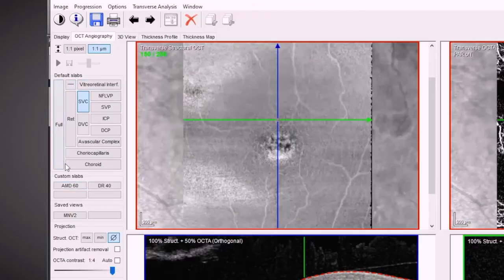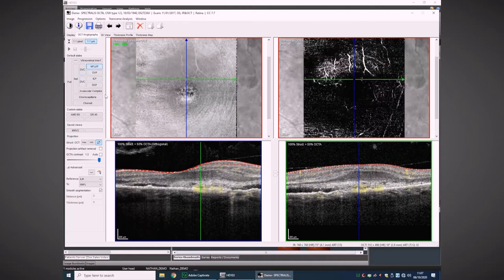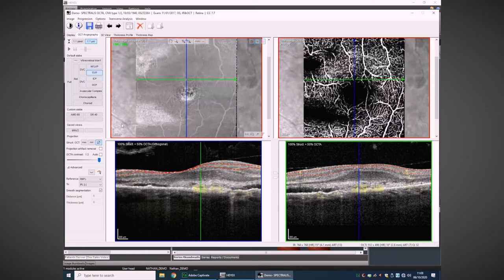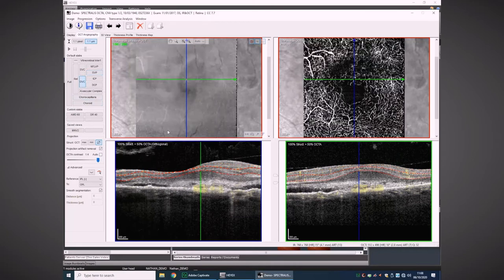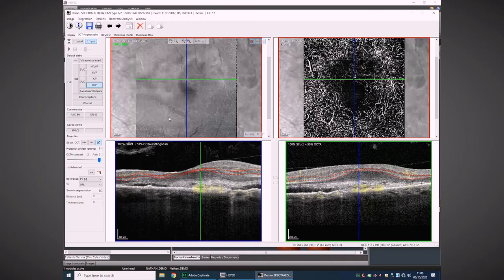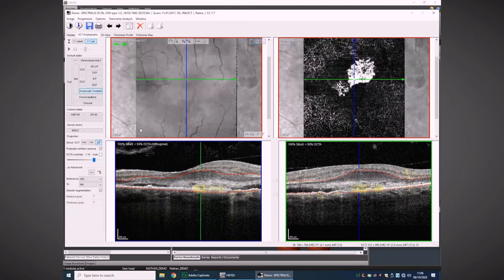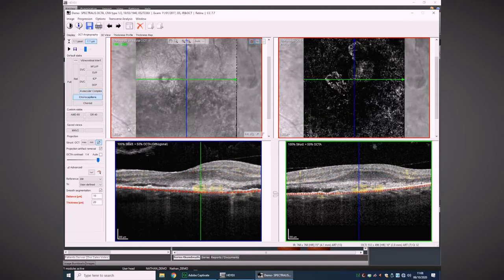In the viewing window we can walk through three-dimensionally down through the different plexus of the retina right through to the choroid. The default setting is the superficial vascular complex, which contains two plexus: the nerve fiber layer vascular plexus and the superficial vascular plexus. Moving down we have the deep vascular complex, also with two plexus — the intermediate capillary plexus and the deep capillary plexus — which may be important in diabetic patients, as early diabetic changes occur in the deep vascular complex. You can then move further down into the avascular complex, and finally to the choriocapillaris and the choroid.